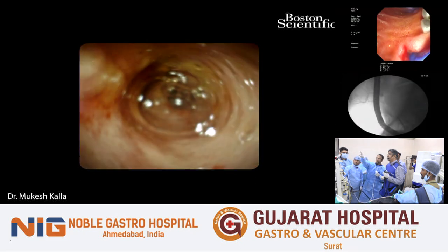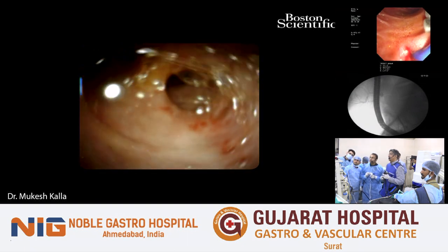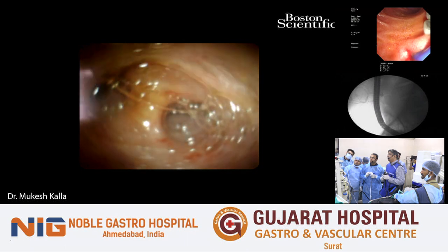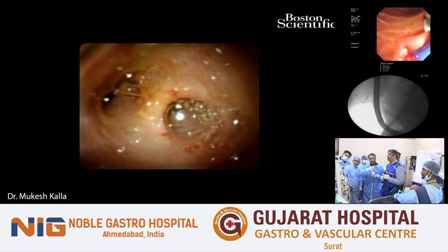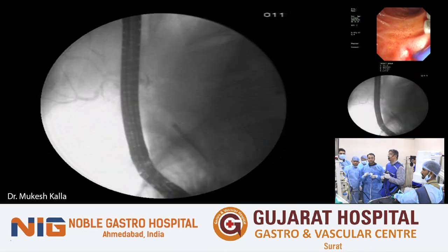I think here is the cystic duct opening. Yes. So now we have two openings here. Left side probably appears like a cystic duct. It may be either. You may be right.